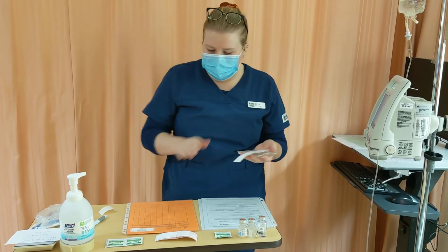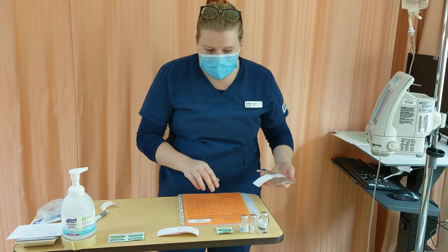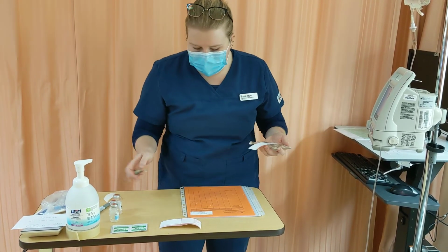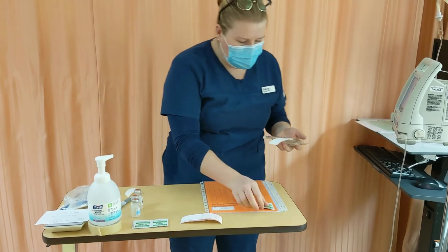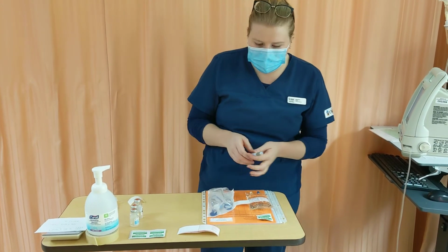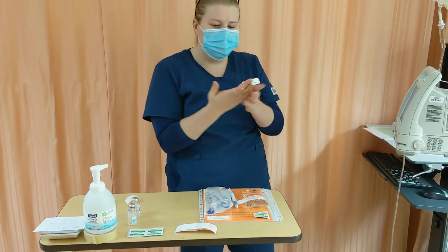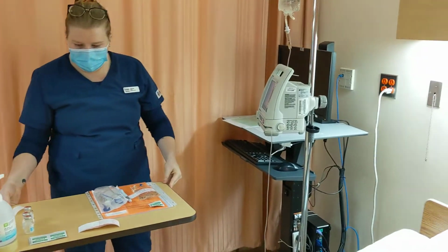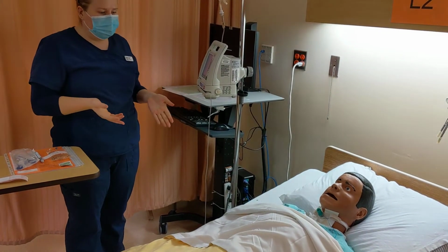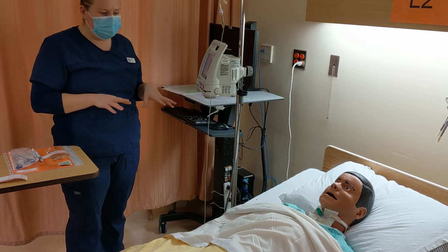So I have my mini bag, I have my MAR, I have my alcohol swabs. These medications can go back. Medication and sterile water. I have my alcohol swab, my mini bag, my pen, and my correct tubing. Once I have all my supplies, I'm going to wash my hands and go to the patient's room. Upon entry, I'm going to make sure I wash my hands, and do my entrance safety check, making sure the bed's in the lowest position and the patient's in no distress.